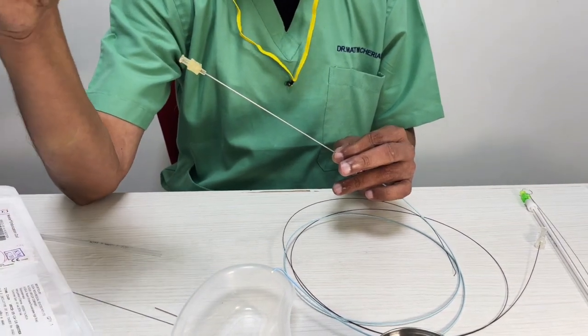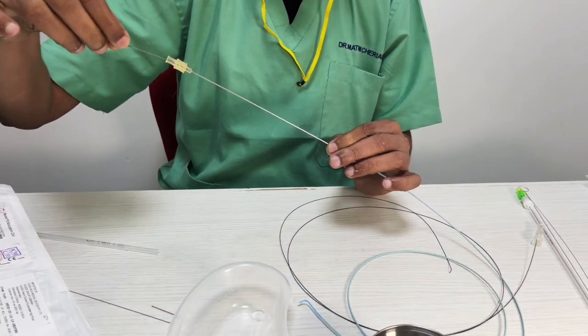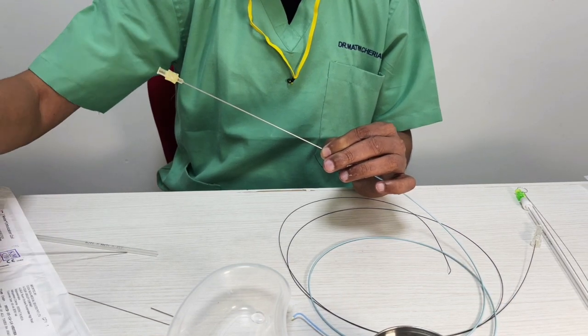Now this is stiff. This will not take that bend, it gets very tough. So remember, you will not use this. Now to start pushing, you can use a stiff end to just allow it to enter inside the catheter. So you push it to a certain level. Once you push it to a certain level, then you take your soft end and push it.